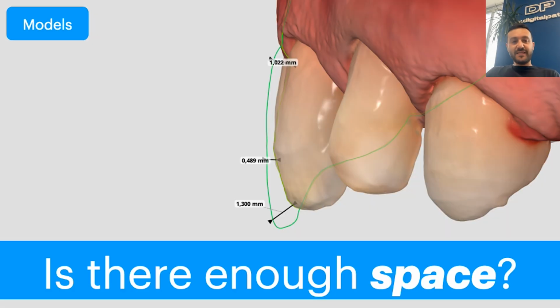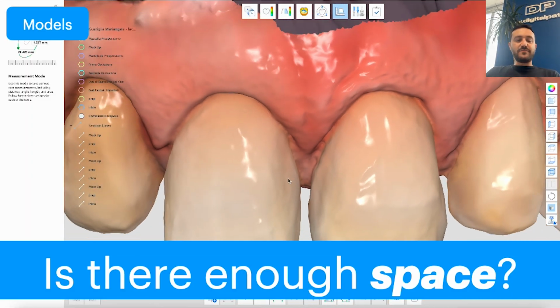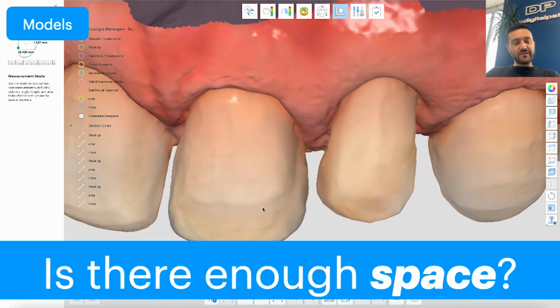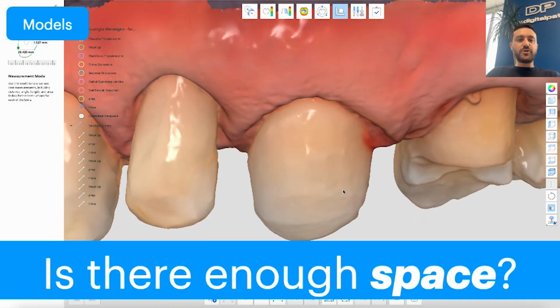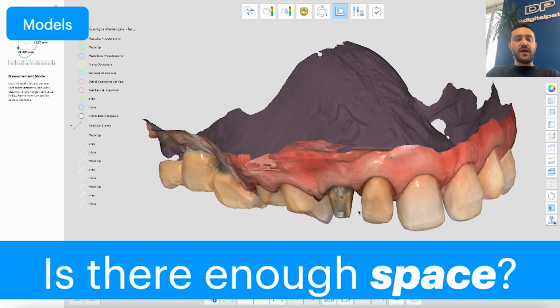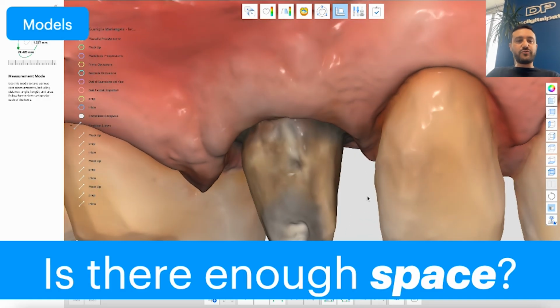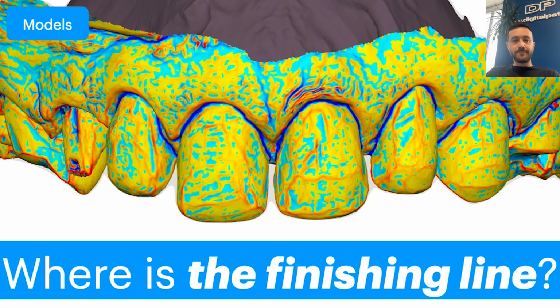Is there enough space? Here is another picture of the space for the restorative. Here is the bridging between the preparation, though it is not bridging because we have a powerful scanner in our hands, and also the preps are good enough to catch the space between the gum and the teeth.